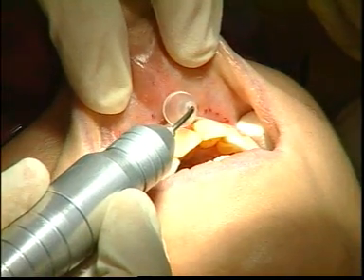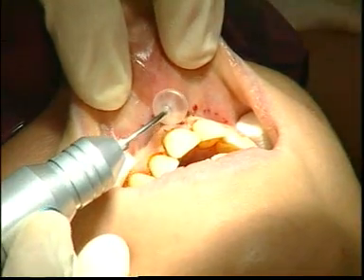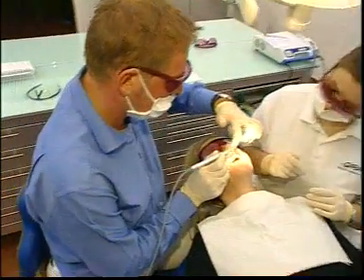The effect of the therapy laser consists of faster and pain-free healing. This can be delegated completely. No overdose can occur.